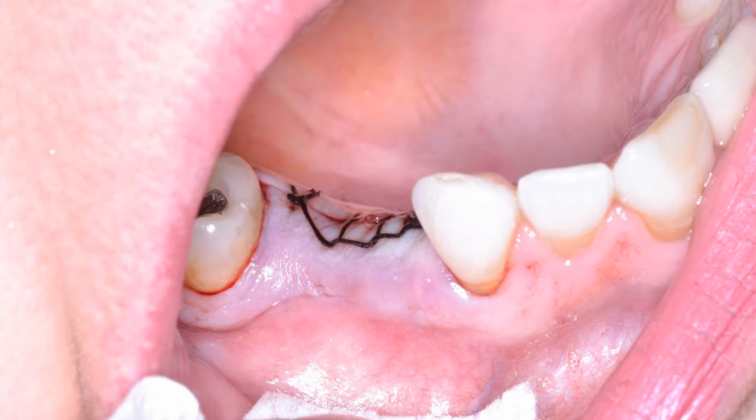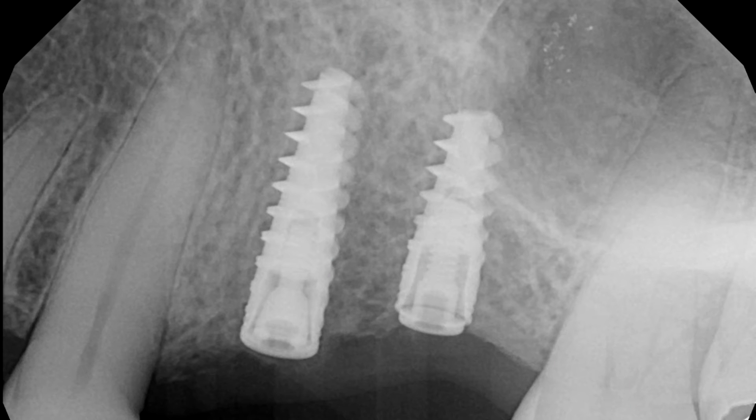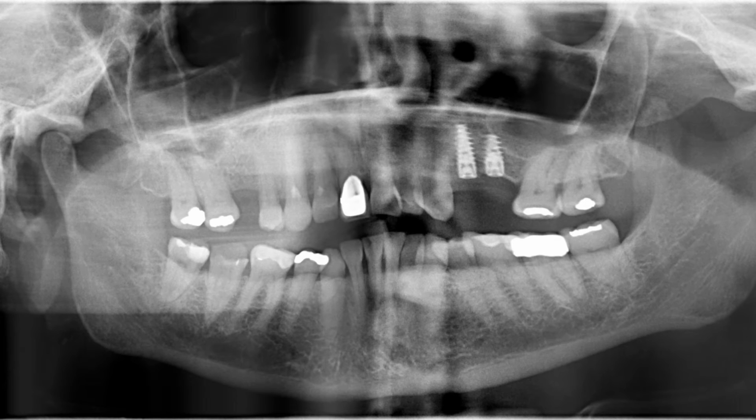We also placed platelet-rich fibrin in this case prior to placing the sutures. Taking a look at the radiograph, one can appreciate the conical nature of the cover screw for the anterior implant, and how the posterior implant is just covering things there and making sure nothing gets inside. You can also appreciate that we were getting close to the floor of the sinus in the matter of the second implant, so observing where the bone levels are. Going to the next slide, we see the panoramic radiograph for this particular patient.